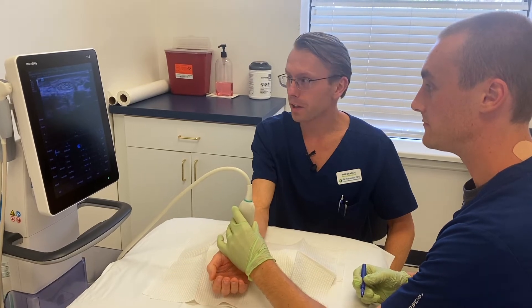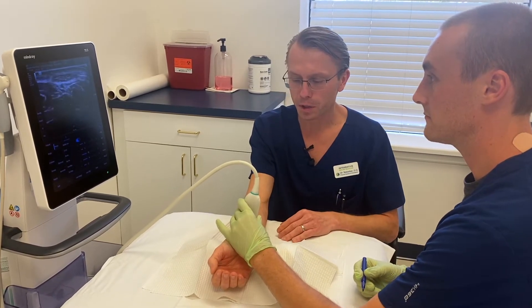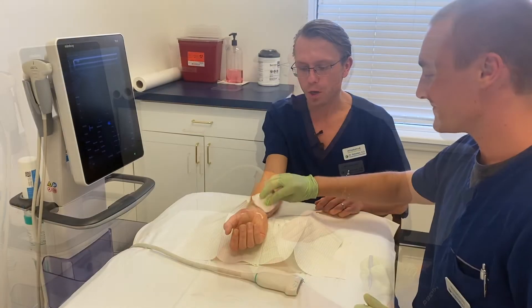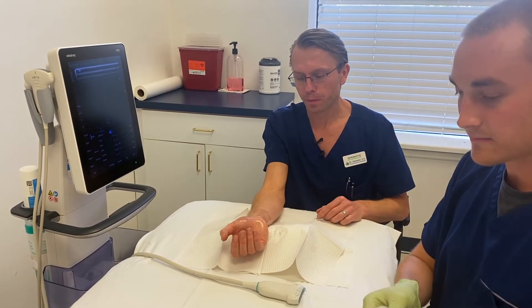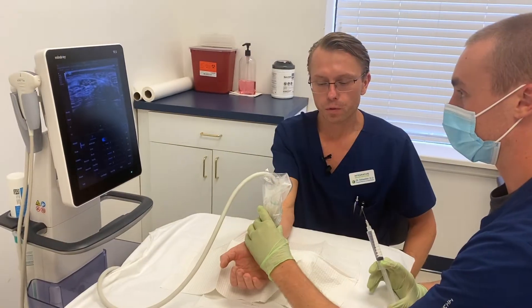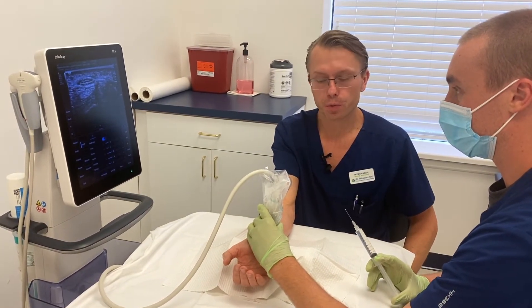First, Floyd is going to identify the nerve on the ultrasound, then mark his landmarks and prepare the area for the injection. He's going to clean and sterilize the area with a cleaning solution. Floyd now has the ultrasound probe in a sterile sleeve and we're going to get started with the procedure.